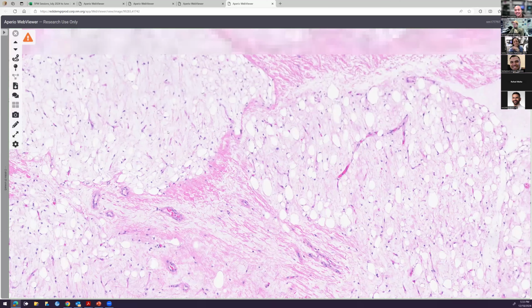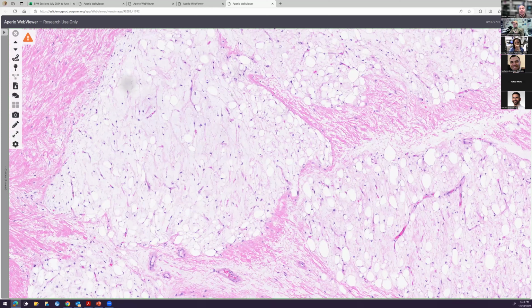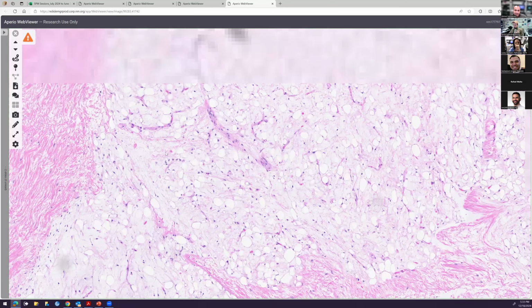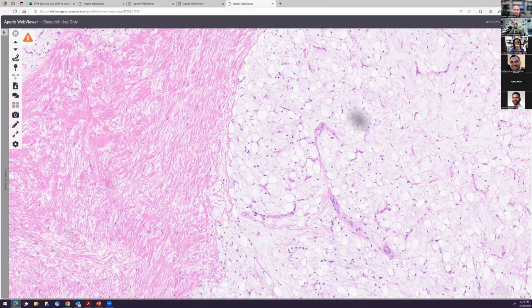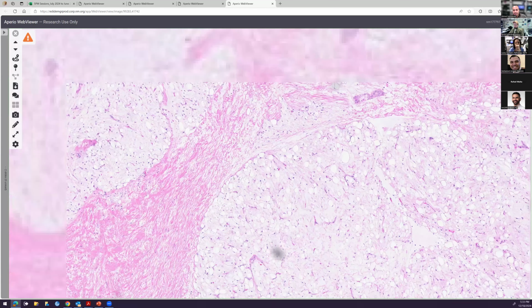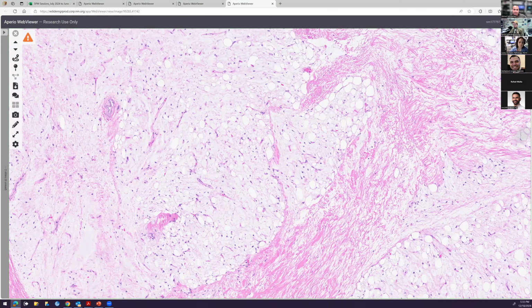It's scary, right? Okay, so I'm showing this specifically because this is one of the biggest differentials with lipoblastoma, myxoid liposarcoma. This actually does not have the fusion, and morphologically, it has a better look for lipoblastoma overall. And it's in a much younger patient, I think like a 10-year-old. So this is very scary though. You really want to think about myxoid liposarcoma when you have a more adult patient with morphology like this, and if it looks like a lipoblastoma, you may consider doing fusion testing as well.